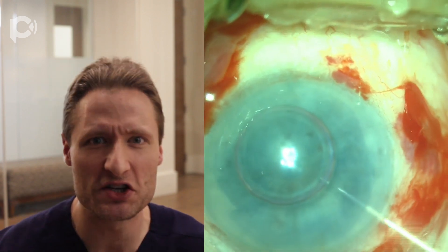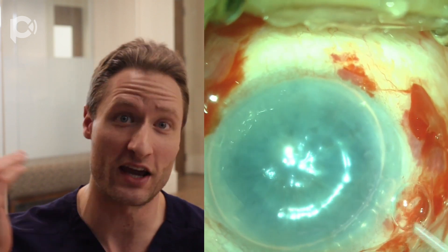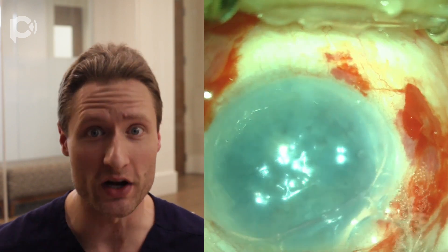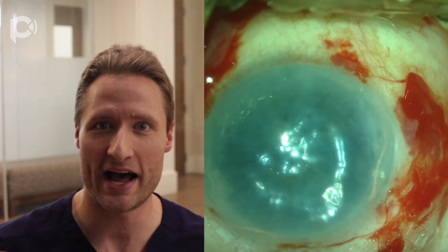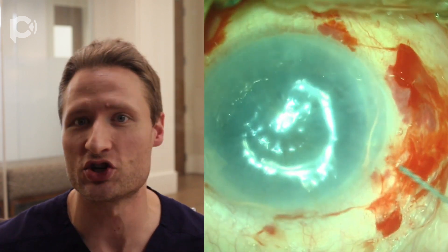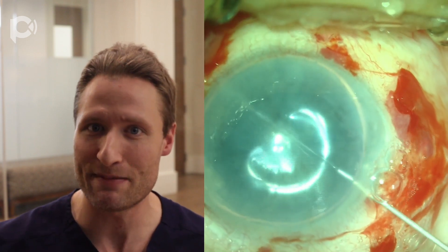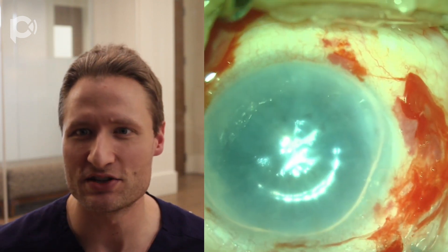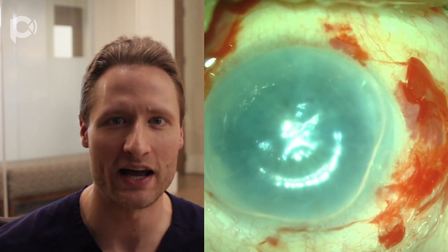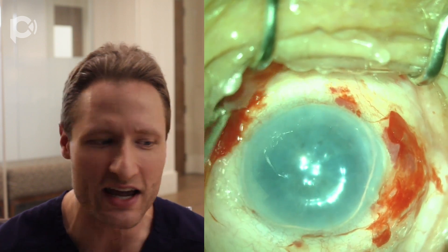This is such a handy and useful trick to use in eyes that are post-vitrectomy or otherwise have deep anterior chambers. You will inevitably encounter these cases — grafts that are tightly curled in eyes with deep chambers where you think, how in the world am I going to unfold this graft? You'll never do it through chamber shallowing alone. The only way is using air bubbles: a bubble on top to hold the graft open, then a bubble below to lift and displace the top bubble. That is the double bubble technique that Takahiko Hayashi pioneered. We use it all the time doing DMEK in eyes with deep chambers. Give it a shot — I think you'll like it.